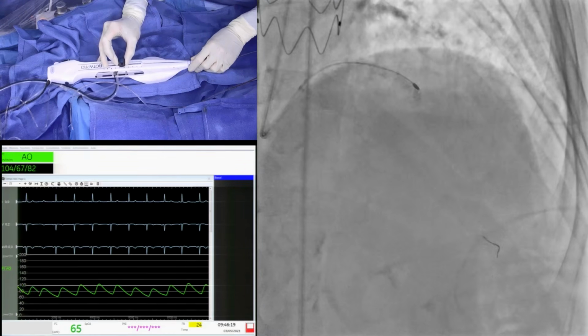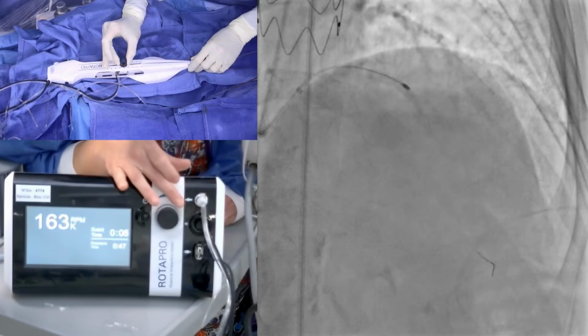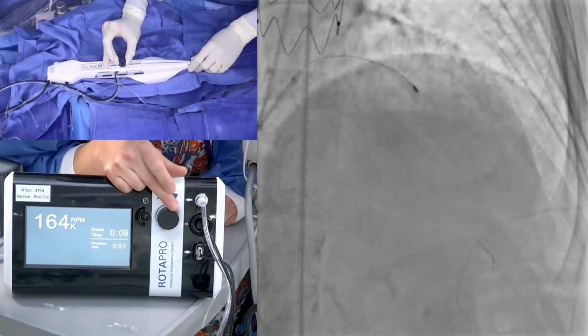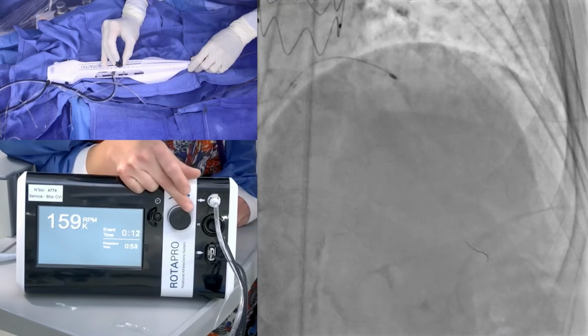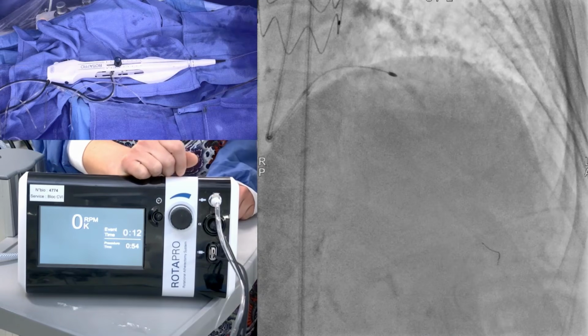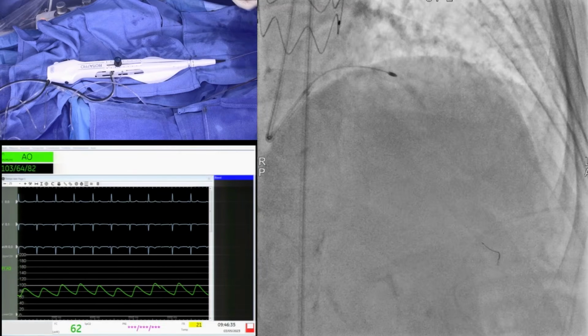You can feel and hear the resistance. We are on the proximal part of the tight stenosis, so go slowly, very short runs, try to engage the lesion. Please do not try to cross, because in this tight lesion we would be trapped with the 1.5. You gradually increase the pressure on the lesion, run after run.